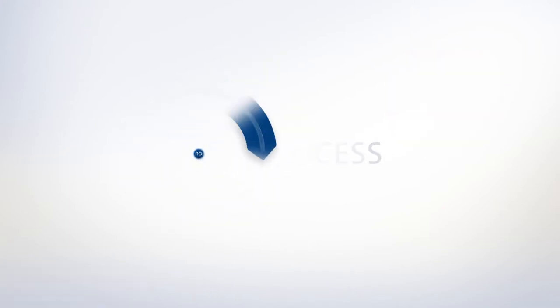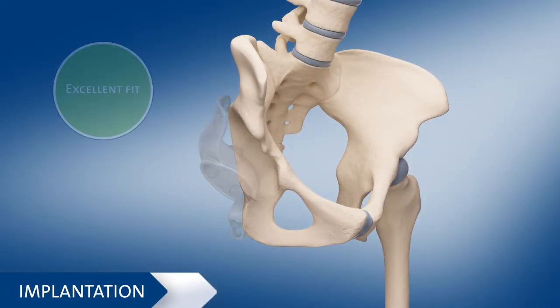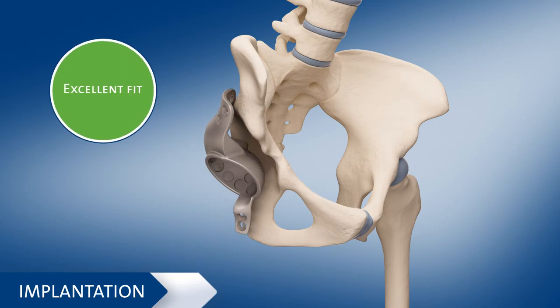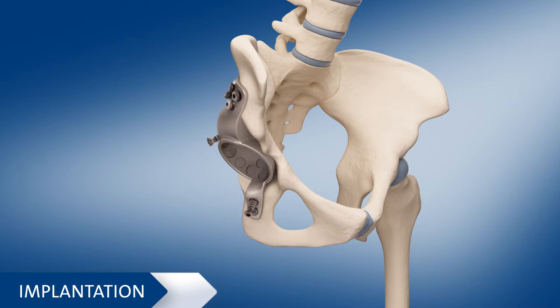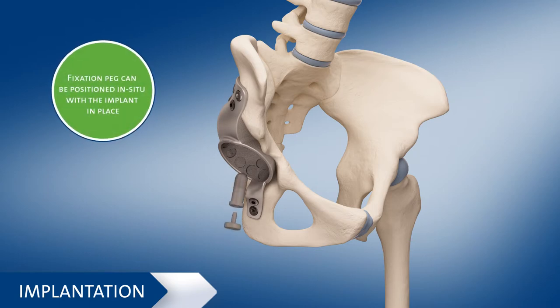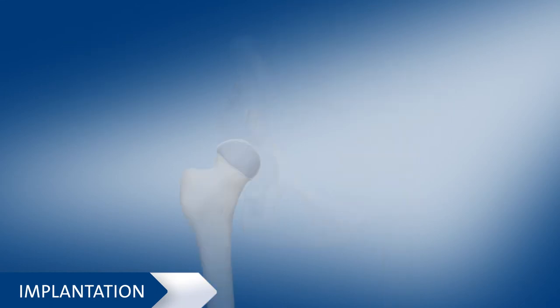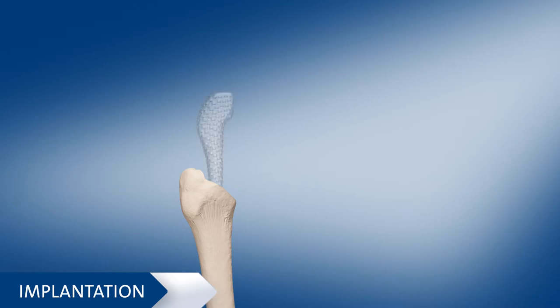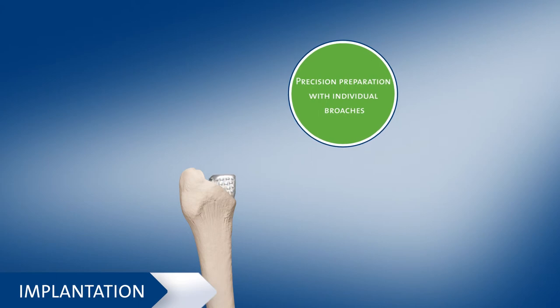Implantation is the final step of the AQI process. The individual hemipelvic prosthesis perfectly fits into the specific pelvic anatomy of the patient and is fixed with screws in the tab holes. The iliac peg is implanted with the hemipelvic prosthesis in place. Individual broaches allow for a precise preparation of the femoral cavity.